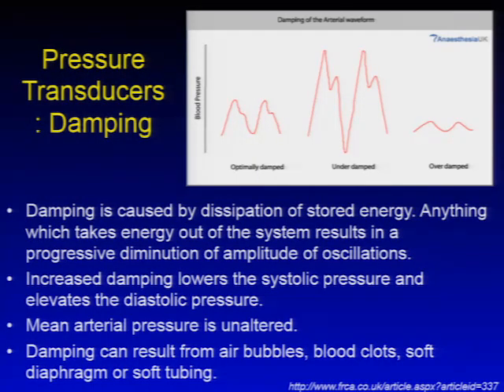Also important to understand the concept of damping in terms of the pressure transducer. Damping is caused by dissipation of the stored energy. Anything which takes energy out of the system results in a progressive diminution of the amplitude of oscillation, as you can see on the diagram here.